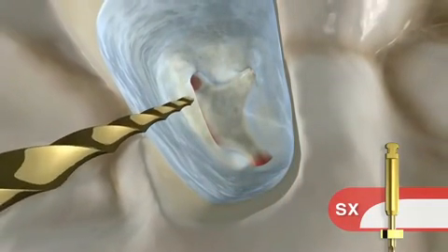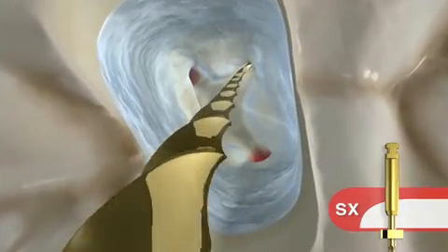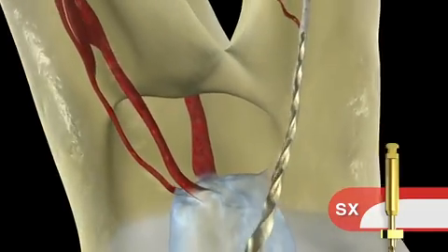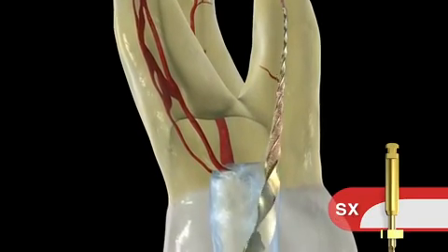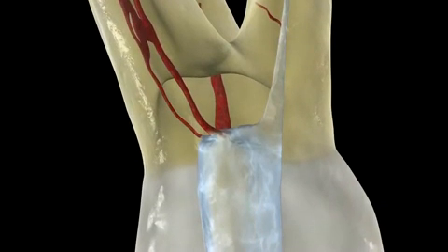So back to the tooth that we've been working on where we had the glide path. With a chamber full of sodium hypochlorite, let's go in with SX. The take-home message is Shaper X is a big brush. I want you to plant that instrument on the outer wall away from furcal danger and brush out on the outstroke, and in one or two passes, you can pre-enlarge virtually any canal. This is done very, very quickly. It's done safely because we had a glide path.